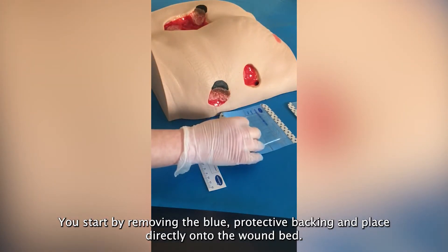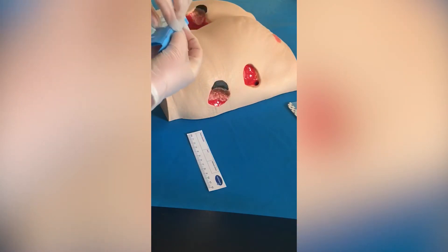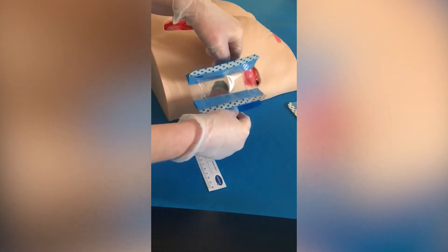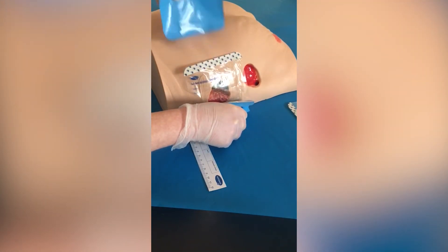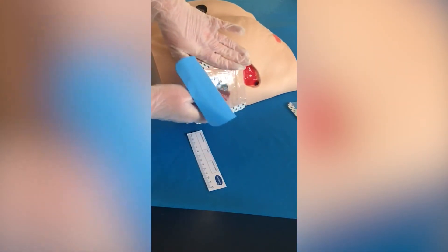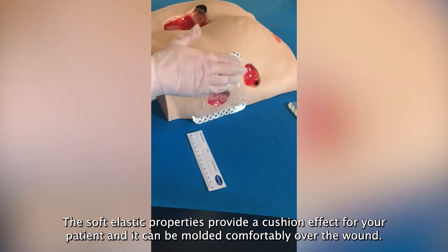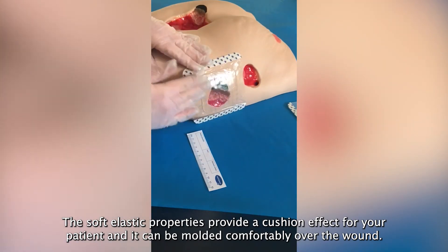You start by removing the blue protective backing and place directly onto the wound bed. The soft elastic properties provide a cushion effect for your patient and it can be moulded comfortably over the wound.